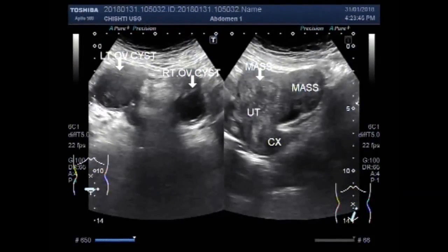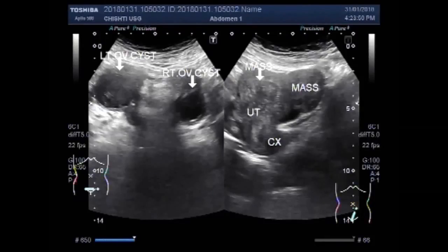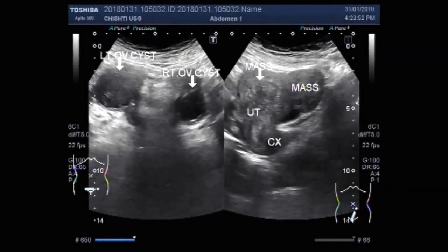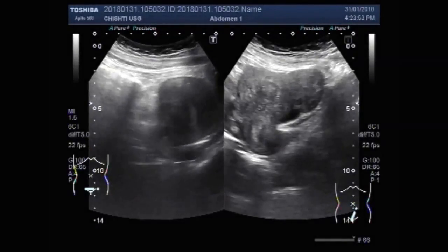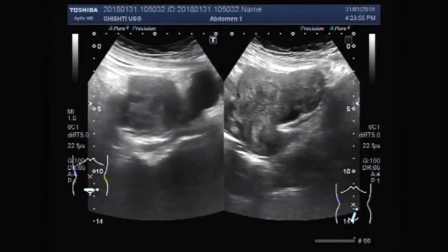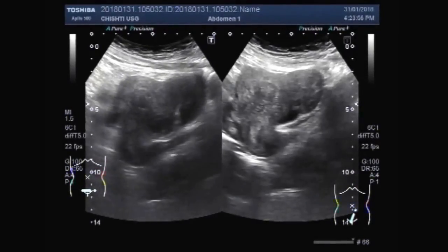Dear viewers, I hope you are all fine. This ultrasound video shows multiple masses and bilateral ovarian cysts.